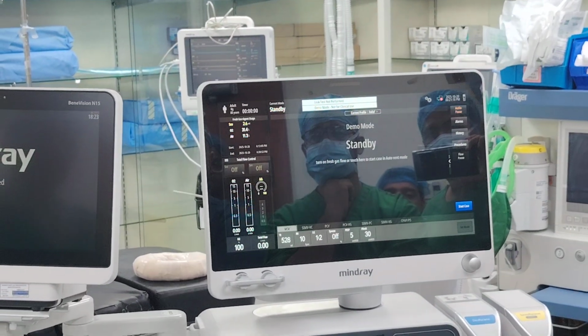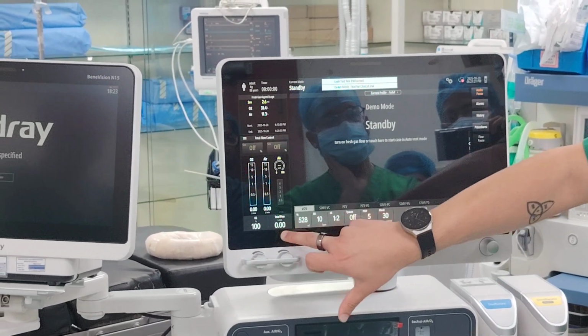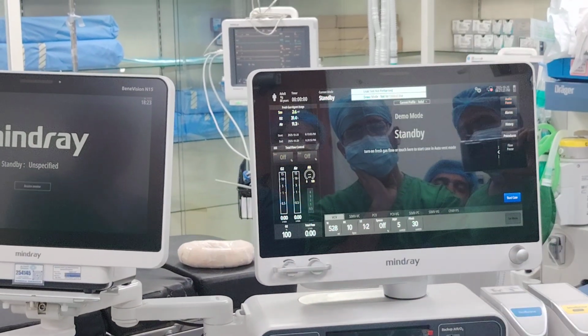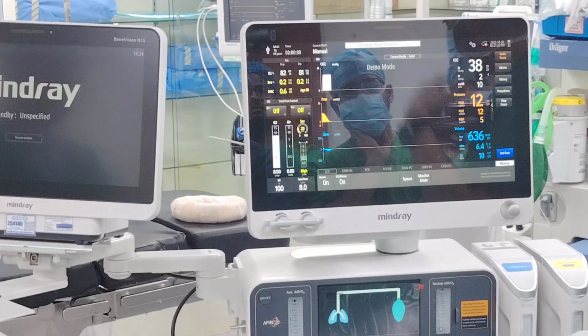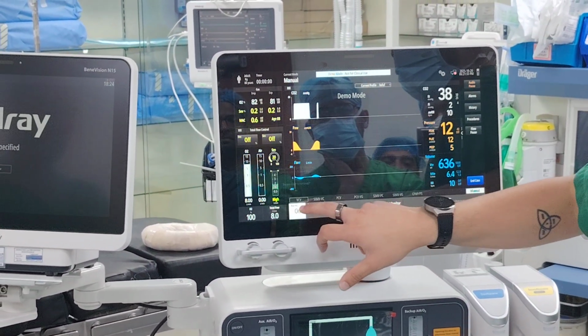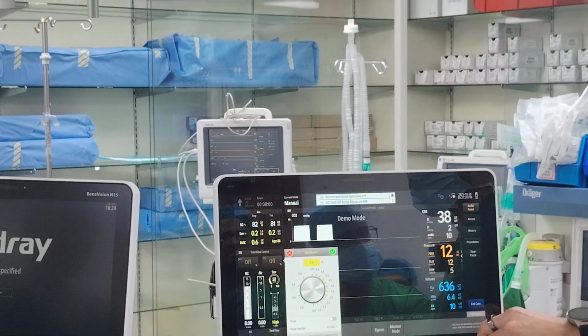I'll start, okay? Prepare my mask. No need to put here 8 liters. I already have this as 8 liters with the settings of 5. So what I do, this will be manual, right? Start case. You mask the patient. Maybe I am a patient, I'm a doctor, I don't like to hear beep, beep, beep all the time. Turn off. Okay? I want to give Sevo, click here, increase Sevo.